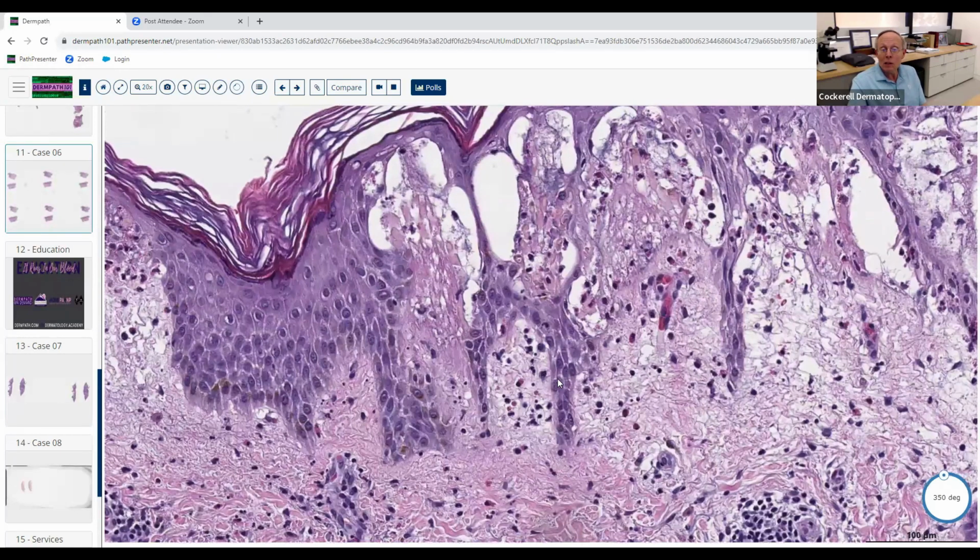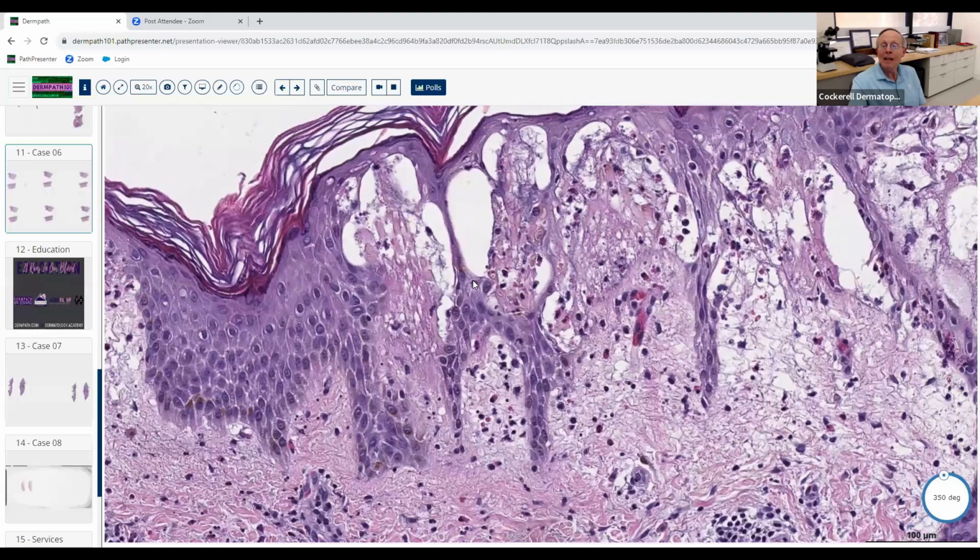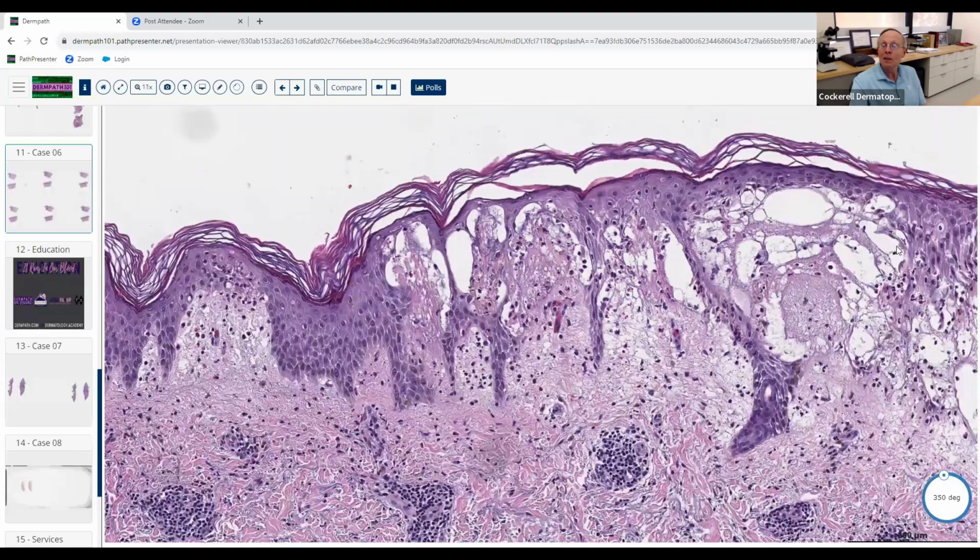Yeah. And if you look at this little area right here, this is a very helpful finding. There are polys here and eos, but there are polys. And where am I pointing here? It's like the papillae. The tips of a dermal papilla. Good. So does that give you any thoughts here?